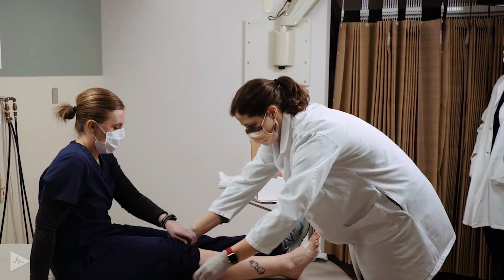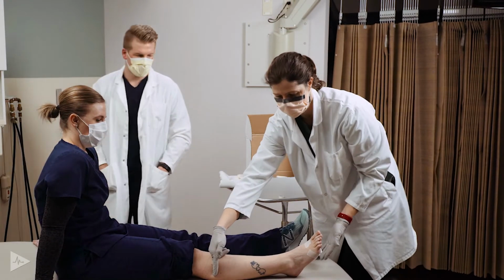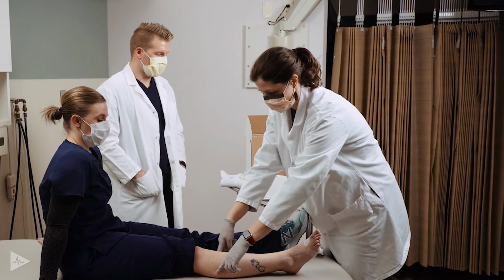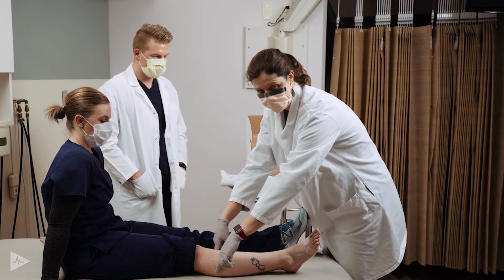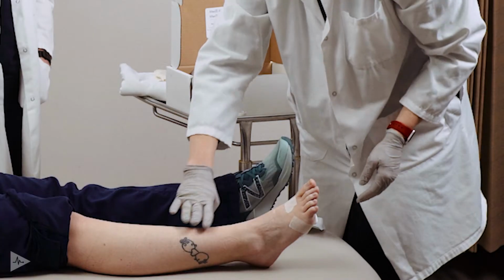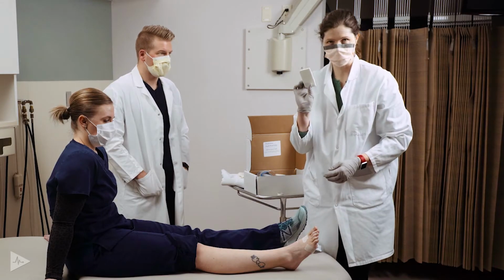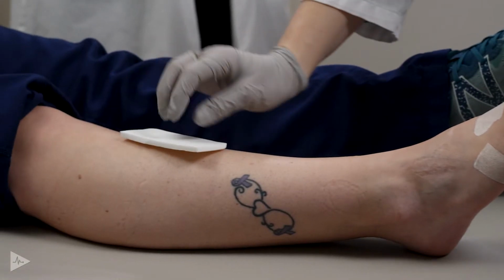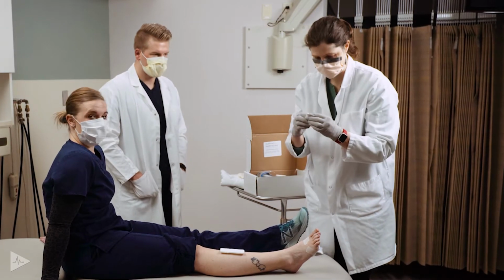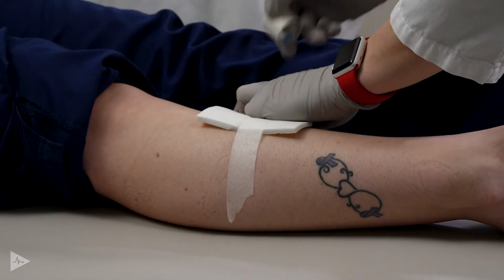And we'll want to bring their pant leg up because the cast will be coming up to just above the widest part of the calf. So you'll always want to assess looking down where the widest part of the calf is and have a mental marker for where that cast is going to stop at the proximal aspect. If the patient has a bony prominence along the front of their shin, you can use the extra foam padding and place that over the shin for additional protection in that area. If you do that, then you can just use the paper tape again to hold that down.